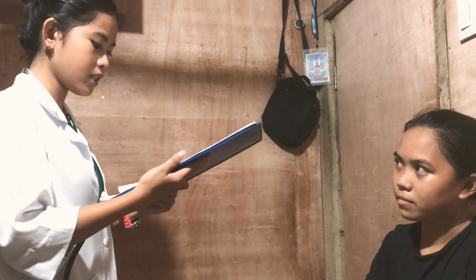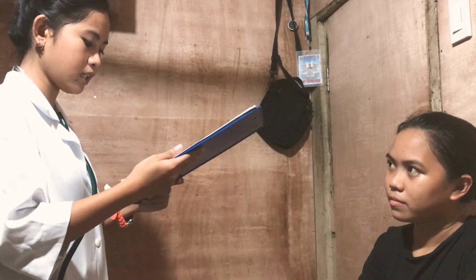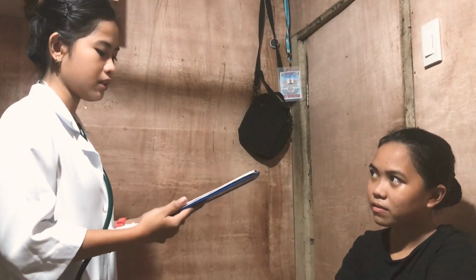Your body temperature is 37.2. Your apical pulse is 85 beats. Your respiratory rate is 15. Your radial pulse is 78. And lastly, your blood pressure is 90/70. Thank you, ma'am.